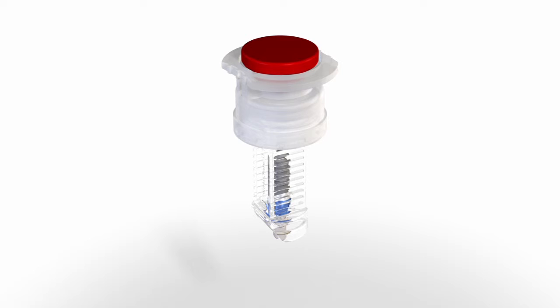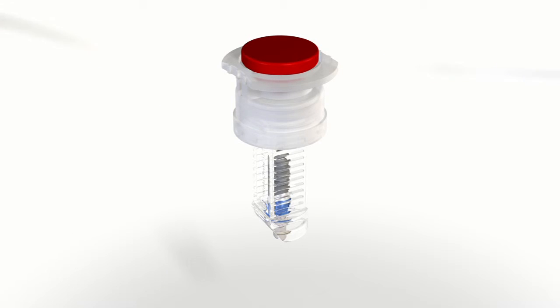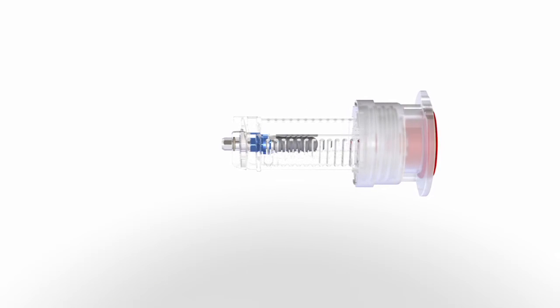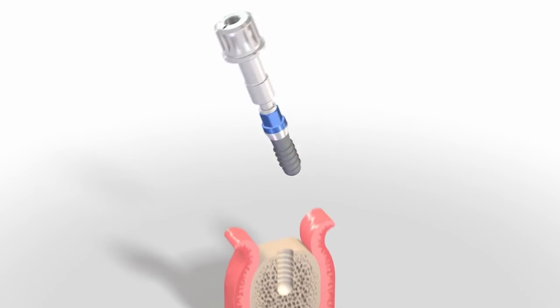A Straumann implant can be placed either manually with the ratchet or with the aid of the handpiece. The implant carrier should be held at the closed end. The adapter then is pushed onto the implant until there's a click. The implant carrier is pulled slightly downward to remove the implant from the implant carrier. At the same time, the implant is lifted from the carrier with a slight twist.